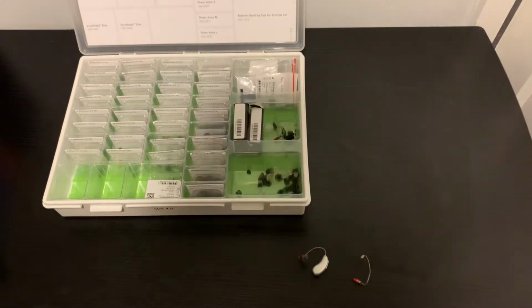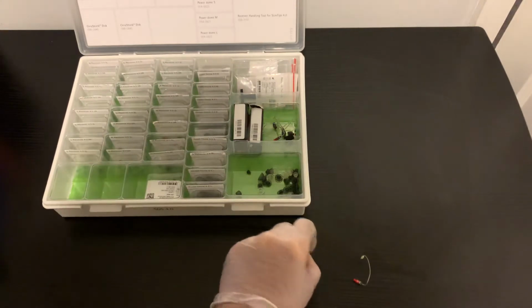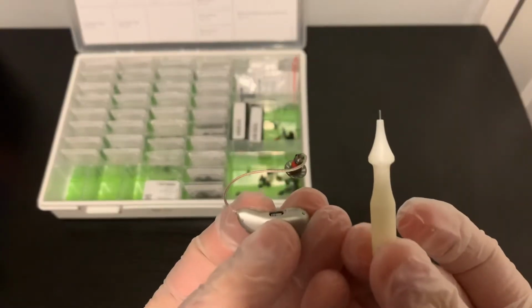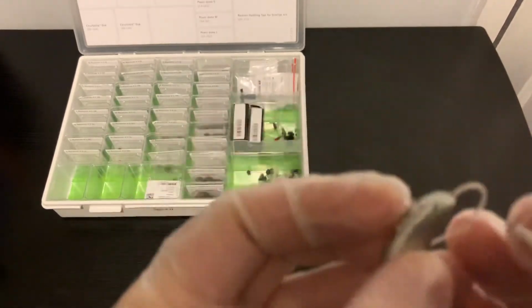Hey YouTube, today we're going to replace a receiver on a Phonak P90 or P70, P50 audio range of receiver hearing aid. You need two things. You need a pin tool, the hearing aid, and of course a new receiver.